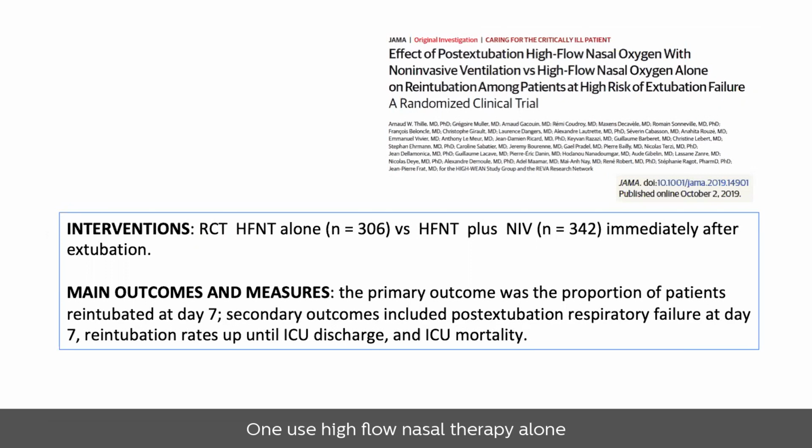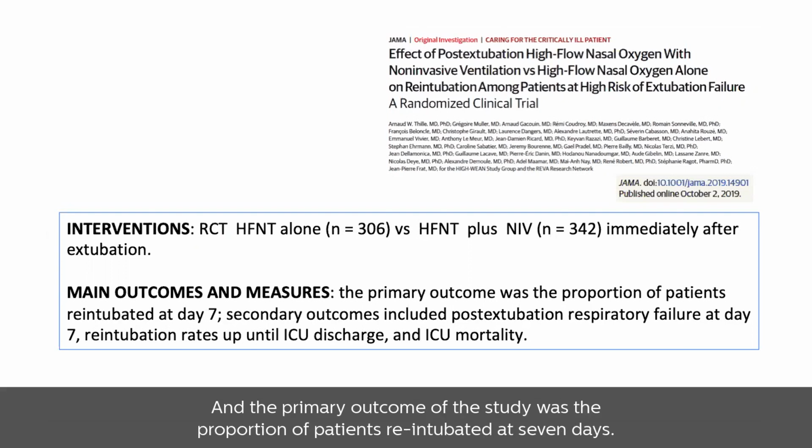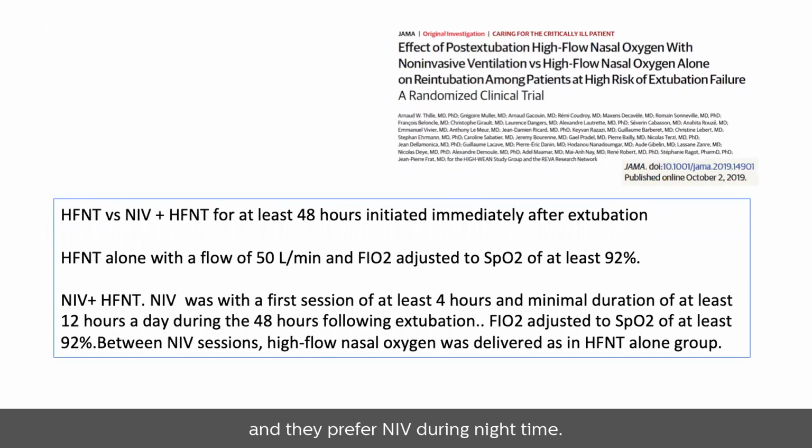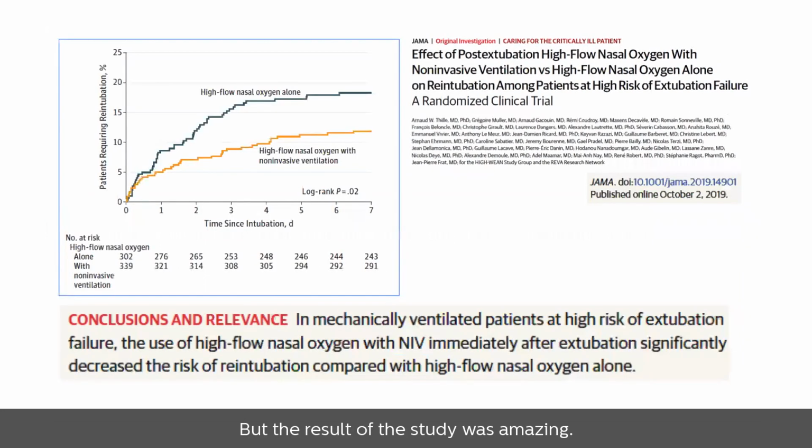One group used high flow nasal therapy alone, and the other group used high flow plus NIV. The primary outcome was the proportion of patients reintubated at 7 days. They used high flow nasal therapy alone, or NIV plus high flow nasal therapy, with NIV preferred during nighttime. But the result of the study was amazing.